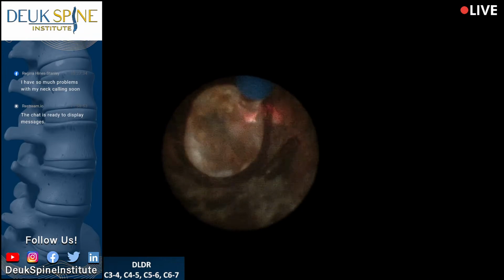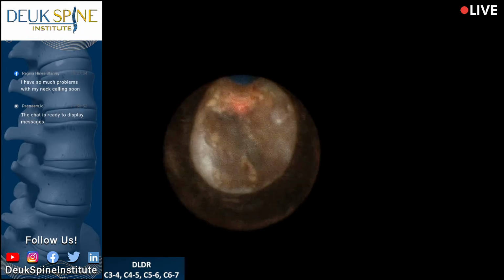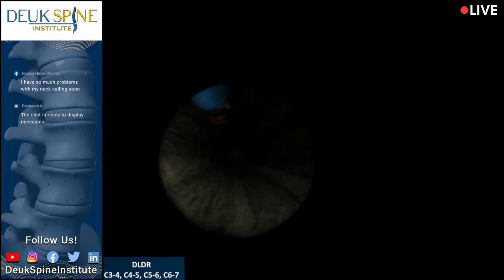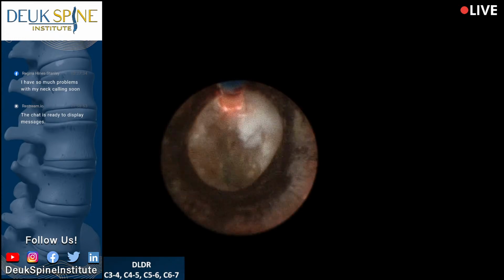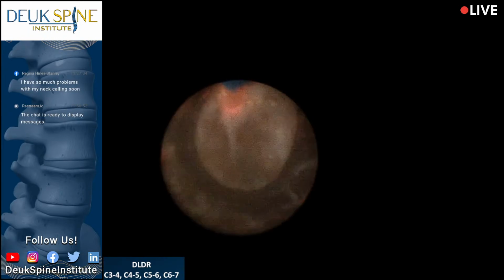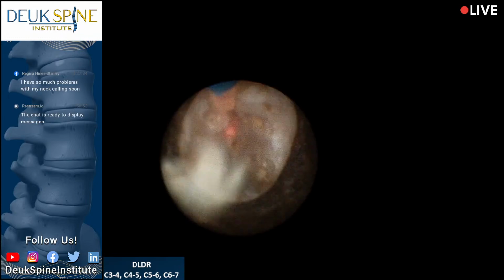Thank you. Yeah. This is all arthritis here. Amazing. And now you can see the tube is moving, okay? Like I said, we do this all the time. We go into a disc that hasn't moved in years. It's just locked in there. It's like rusted together, the two bones. And then we start removing this stuff. And next thing you know, there's a herniation right there. We got movement.